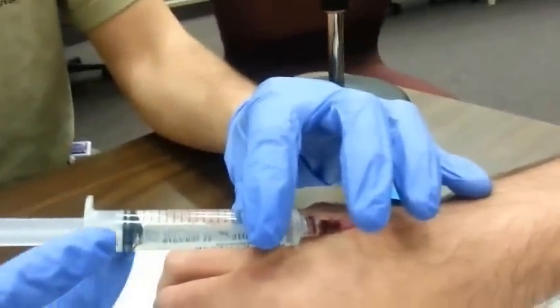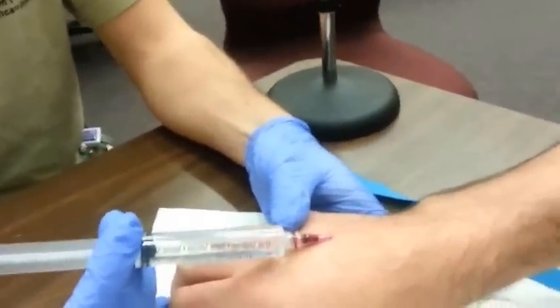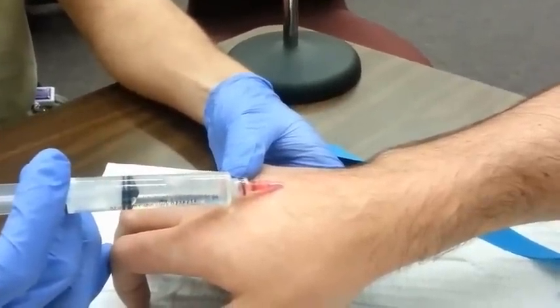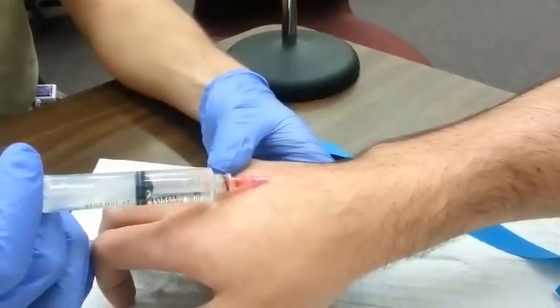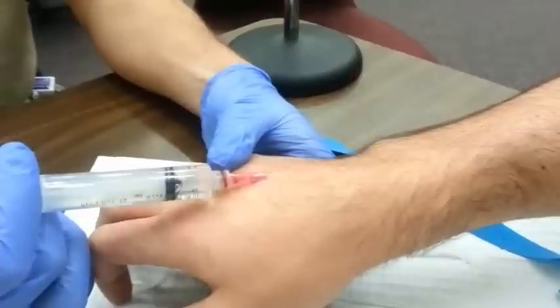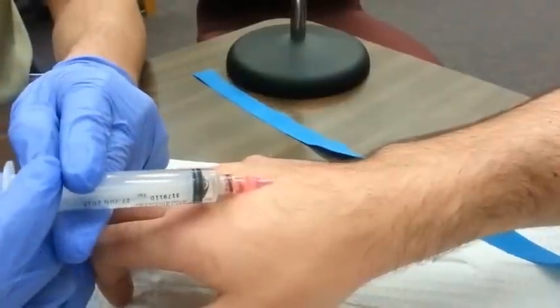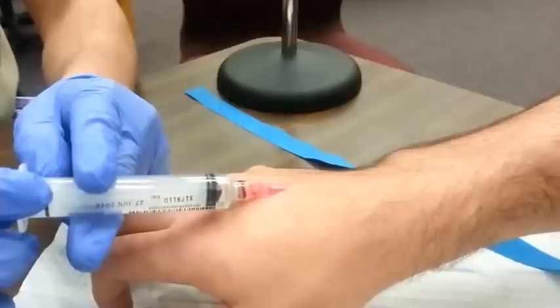Now the practitioner will check the patency of the vein using 10 milliliters of saline in what's called a saline flush. They will screw the saline flush onto the catheter and then inject it. If the vein is indeed patent, it should slide easily out of the syringe and into the vein. This should not cause the patient any discomfort. After the 10 milliliters are inside the patient, you have ensured the vein is patent and can now attach your IV or a cap, whatever apparatus you want to.